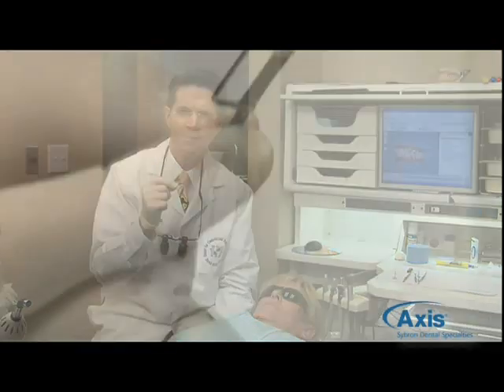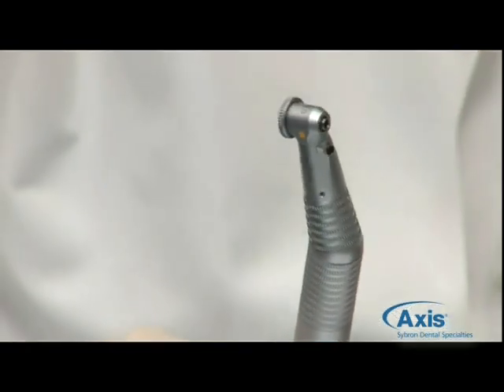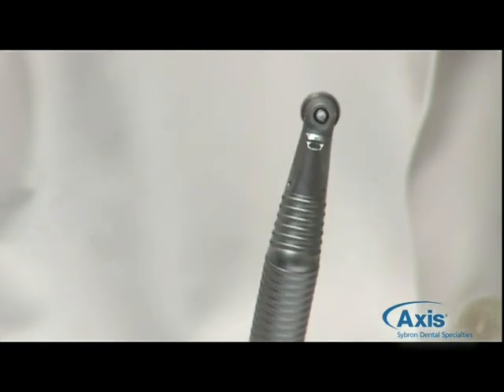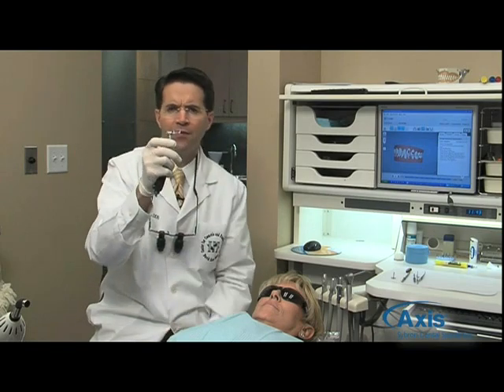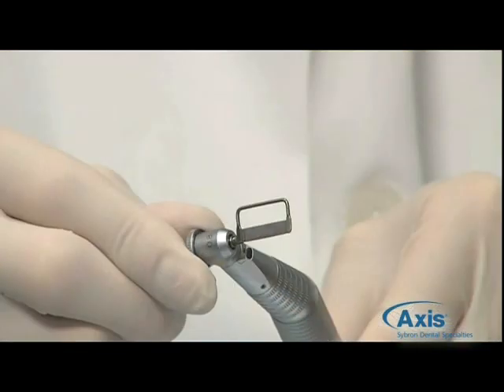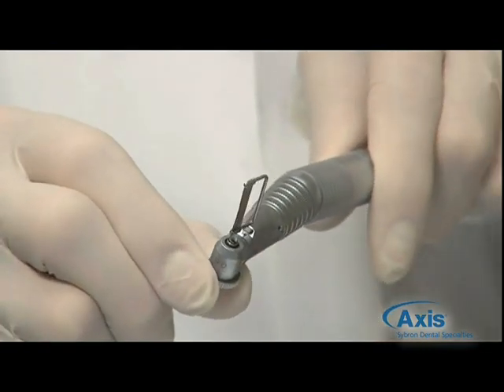In order to use the abrasive ortho strip, you're going to need a reciprocating handpiece. I'll be using the 2061 produced by Cavo. It reciprocates at about 13,000 RPM. It's slid right into the mouth of the handpiece, and then the dial on the handpiece can put it in any position convenient for going interproximally.